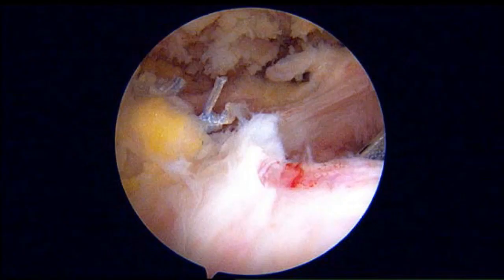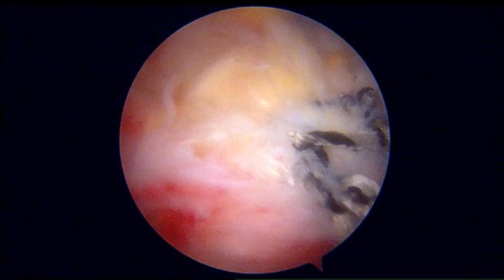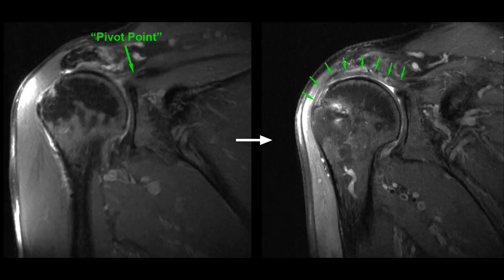Suture tapes associated with the medial row FiberTack RC suture anchors are seen here. Complete repair visualized from the posterior portal and from the lateral portal. Coronal MRI depicting the preoperative tear and then the complete repair of the rotator cuff five months postoperatively.